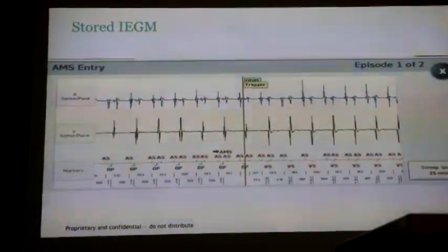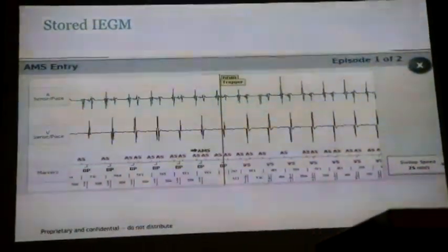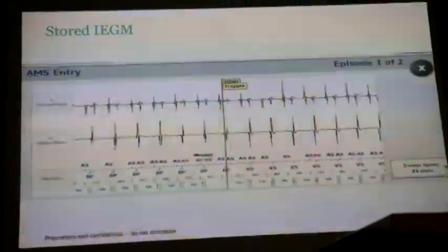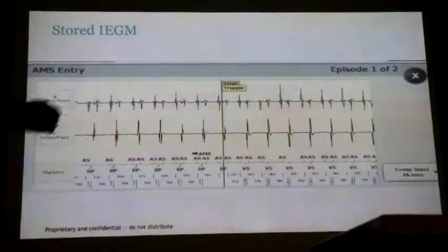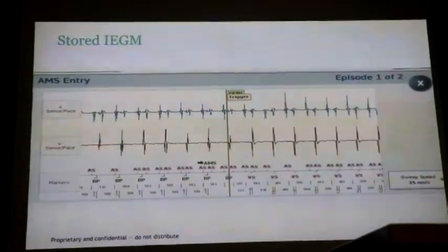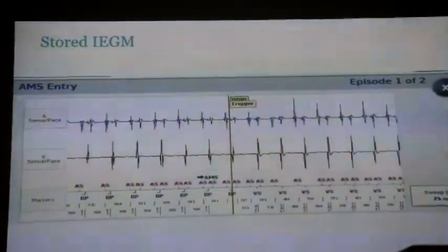If you're giving incorrect information about the atrial rate into that algorithm, there is a potential, not on the way we program today, but on older devices, and depending on your programming, for wrong information to go down wrong channels in SVT discrimination. So a far-field R wave can cause loss of CRT, decompensation potentially, and inappropriate shocks, just this little thing here. So we should pay attention to them.